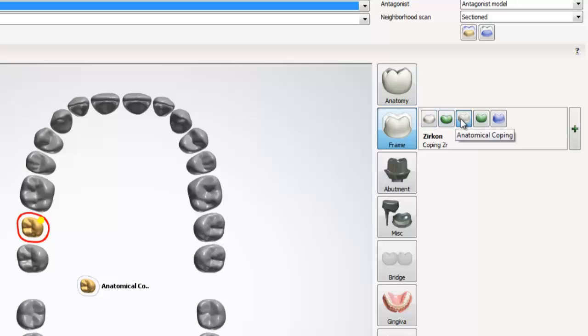An anatomical coping, which is a coping with buildup. An anatomical pontic, which is like an anatomical coping, has buildup. And the last option is wax up, which allows us to scan a wax up and base our design off of it.